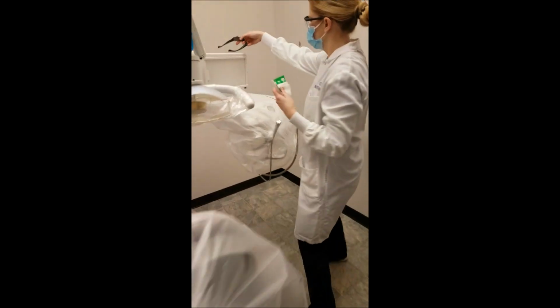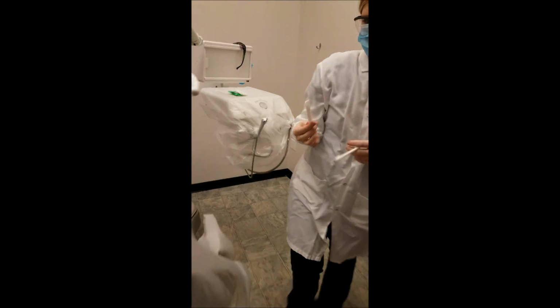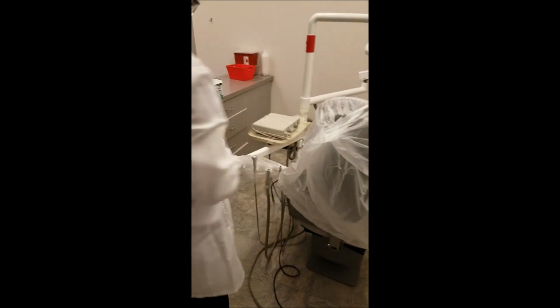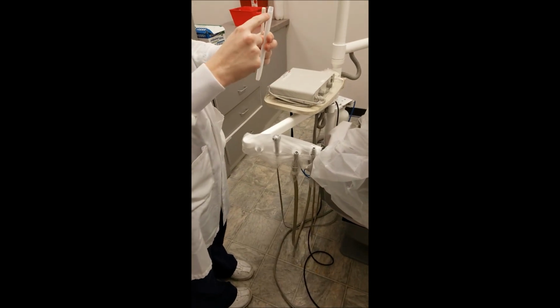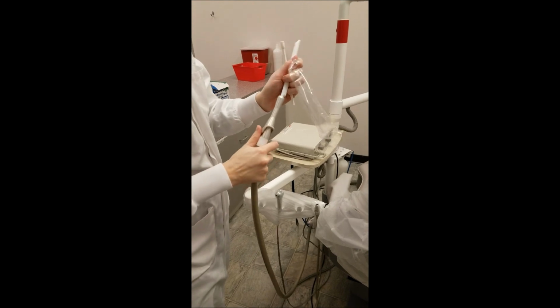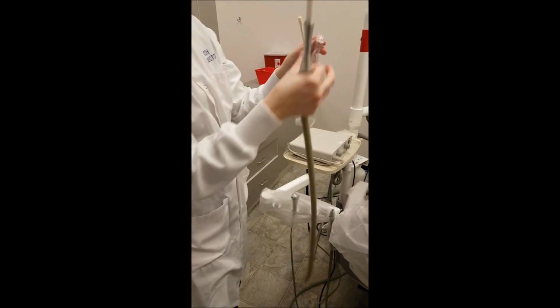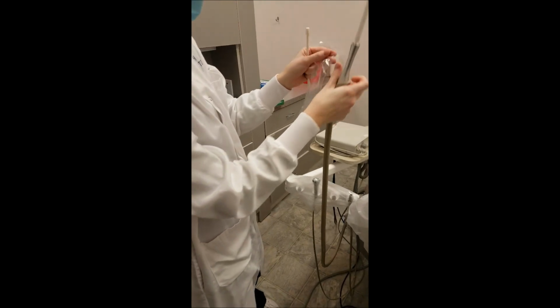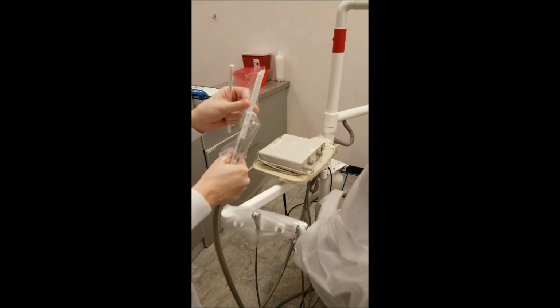And then another helpful hint on this part, you're going to actually have to set up your suctions because you're going to need them later on in your PE. When you put your high volume evacuation on, you always want the hole facing up and not down into the tube. There's a spot without perforations, and you're just going to go right into that.